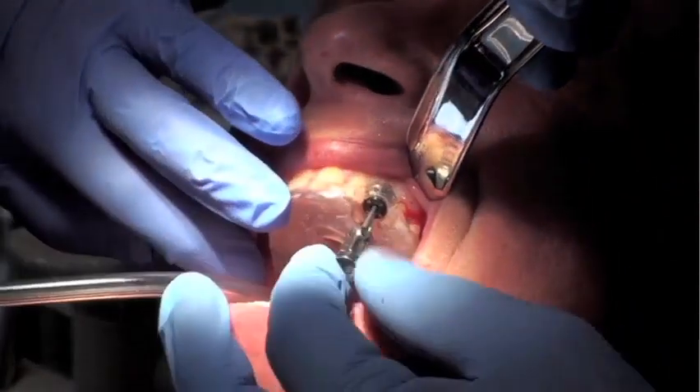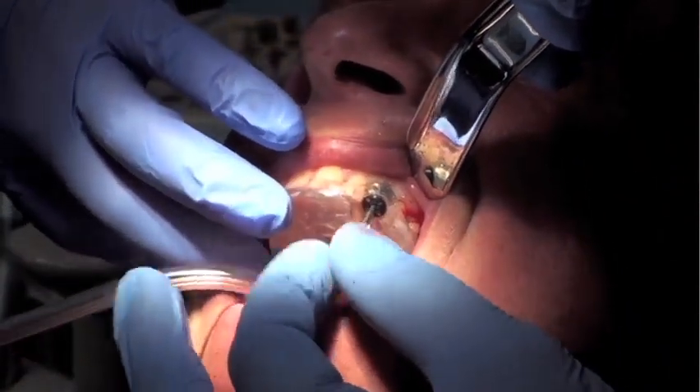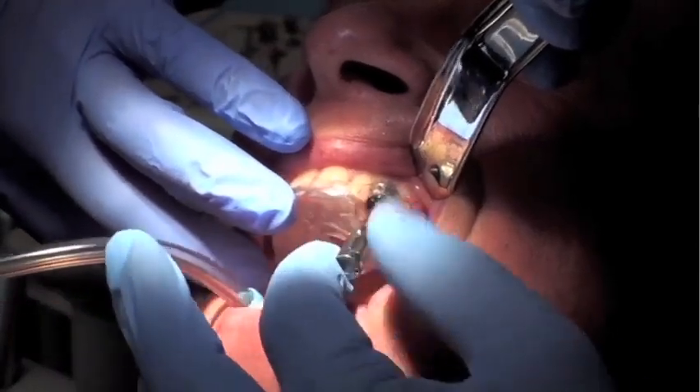This is absolutely critical. Otherwise, if a surgeon were to attempt to remove the surgical guide, the implant would come out with it.